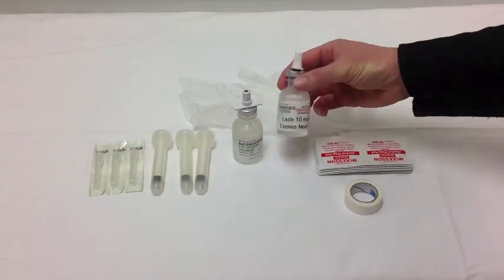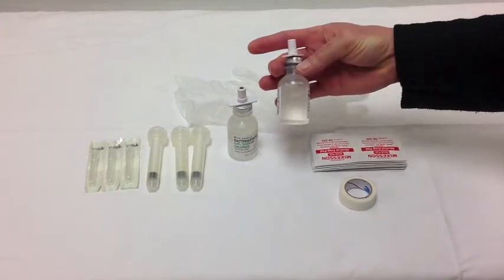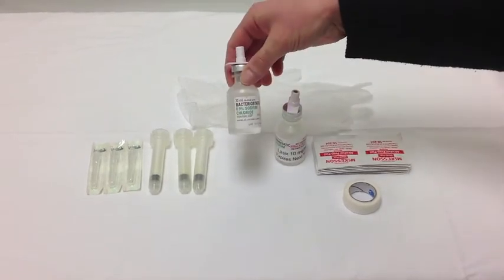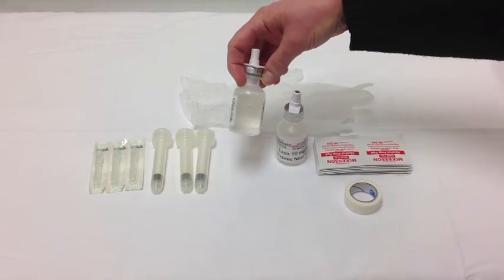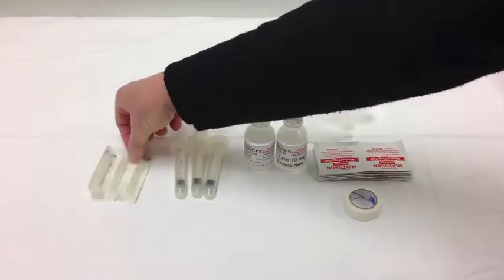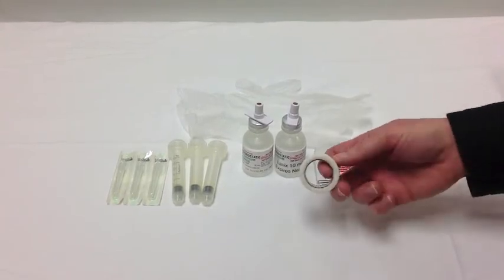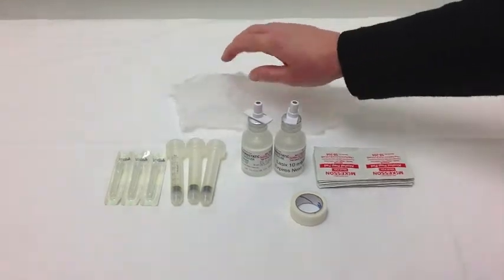Now that I've washed my hands, it's time to gather my supplies. My supplies include Lasix 10 milligrams per ml, which expires next year. And I notice that the fluid is clear, there's no sediment, so it looks good to use. I also have my normal saline. It expires in 2018, and the fluid is also clear and looks good to use. I will also need 3 ml syringes, 3 blunt cannulas, a stack of alcohol wipes, some tape to label my syringes with, as well as some clean gloves.